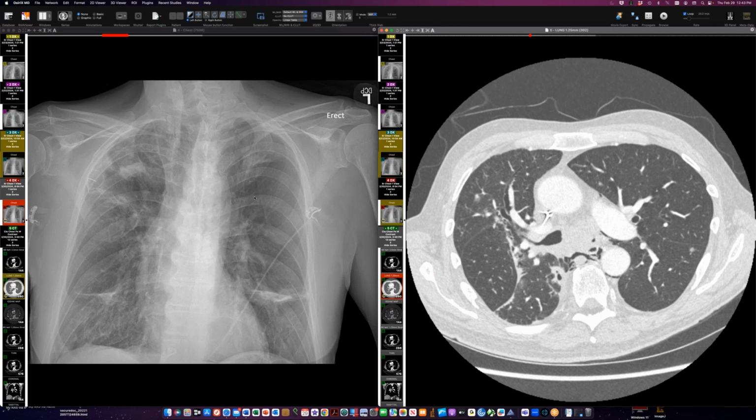So airway obstruction here, you don't want to ventilate, you don't want to intubate a person with airway obstruction like this. So I think they've done some palliative radiotherapy to try to shrink this lesion, and the person's doing better without ventilator support, but on oxygen. So a surprising degree of obstruction of this left bronchus.